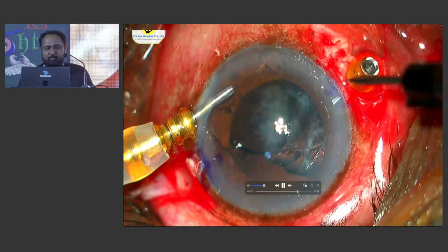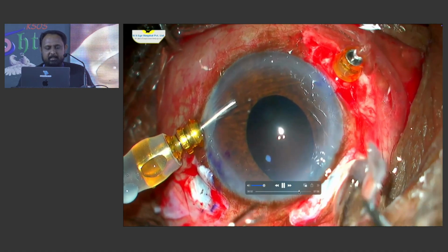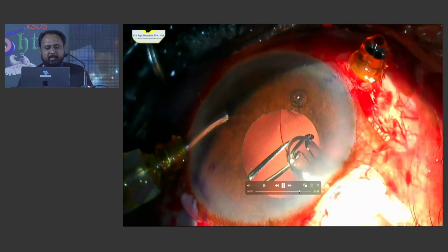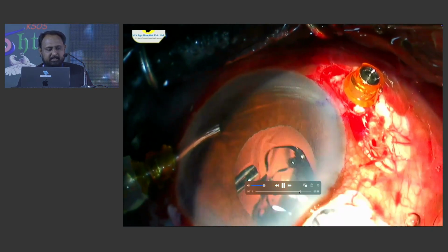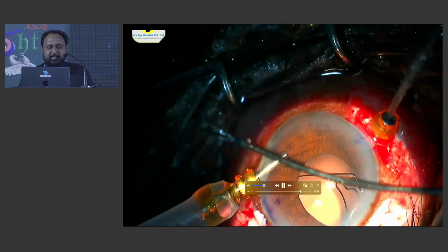So basically we had to remove this lens and then plan for a CMT flex IOL. As I can show you, you can do it in any IOL cartridge. Just grasp it, then they inject the remaining of the lens and then pull it out. These are just small modifications that we are slightly doing now.